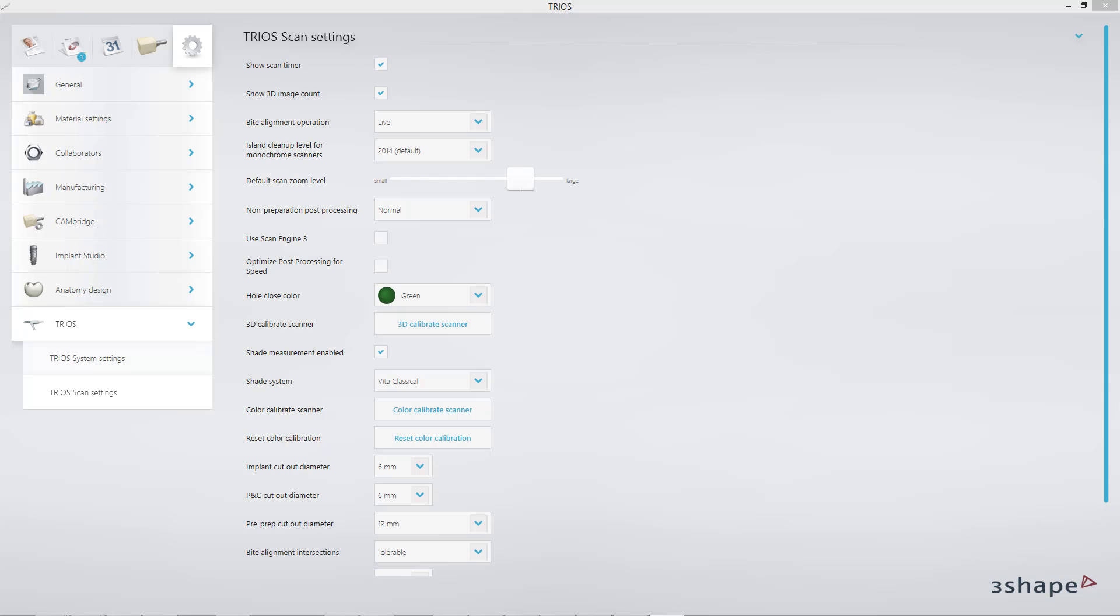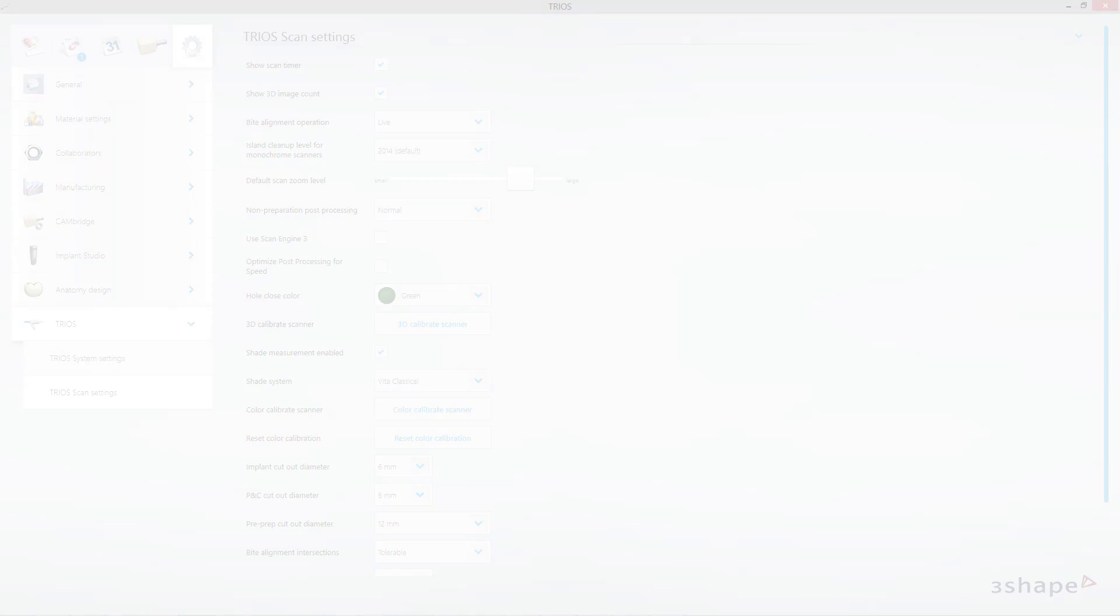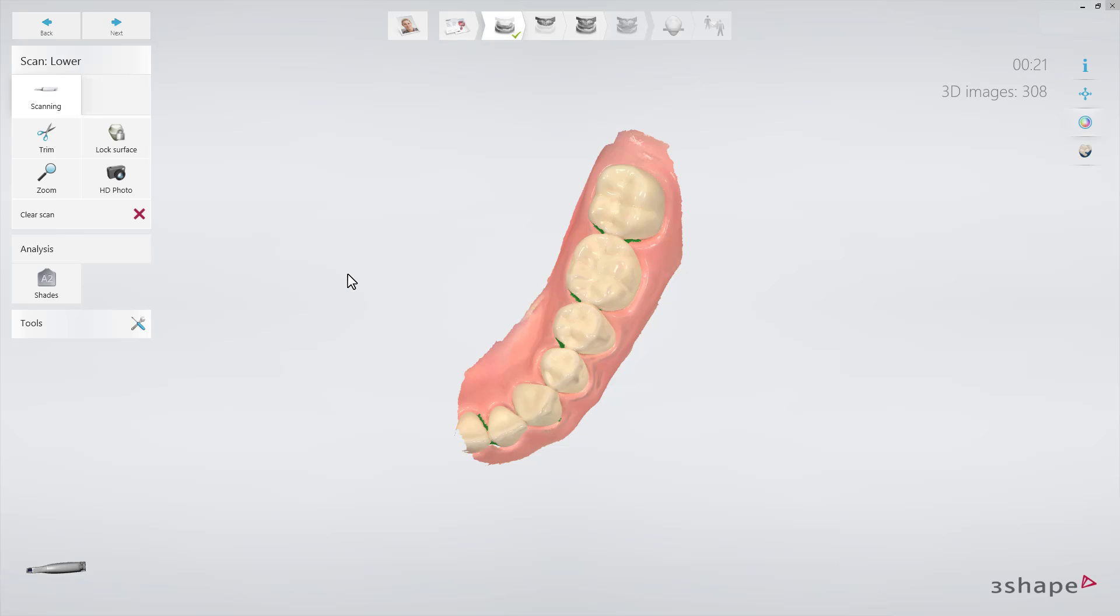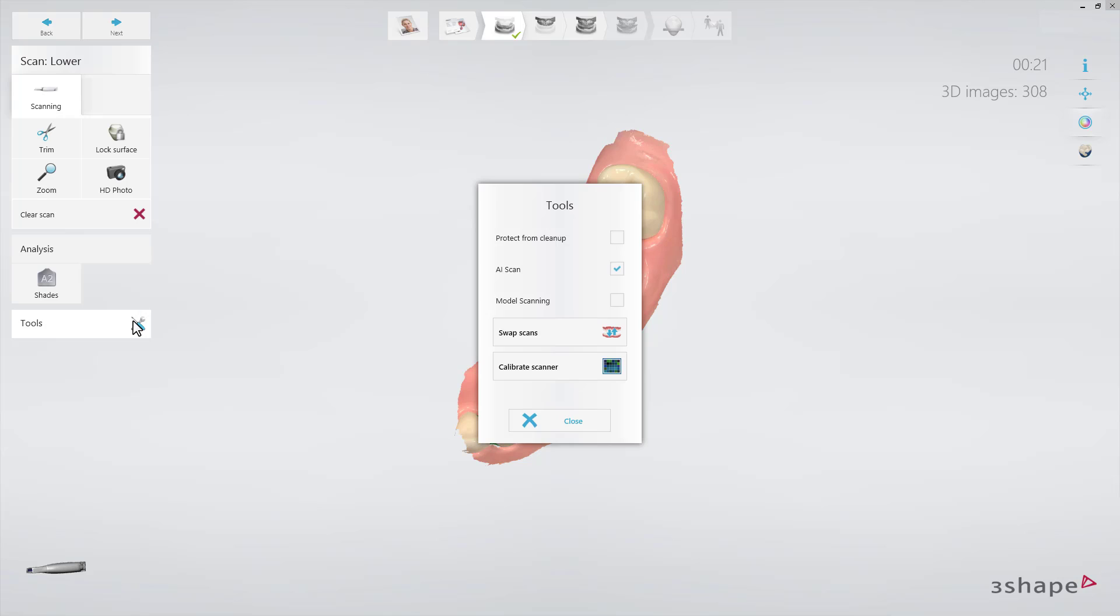In order to color calibrate, press the button Color Calibration on the Scan Settings page. Alternatively, if you need to perform color calibration when you have already begun working on a new order, this option is available on the Scanning page under Tools Calibration.